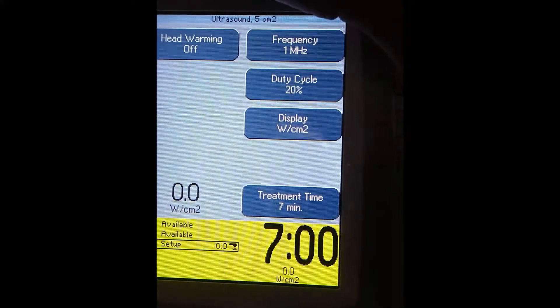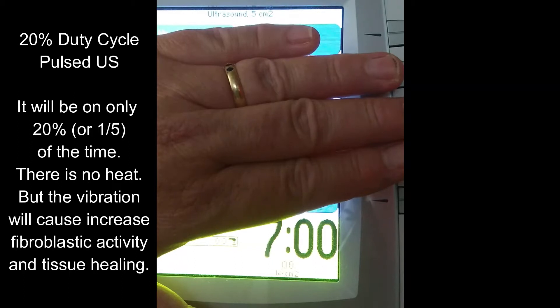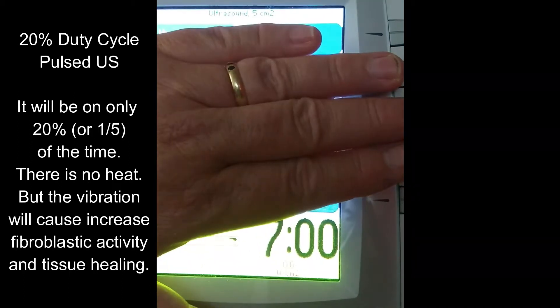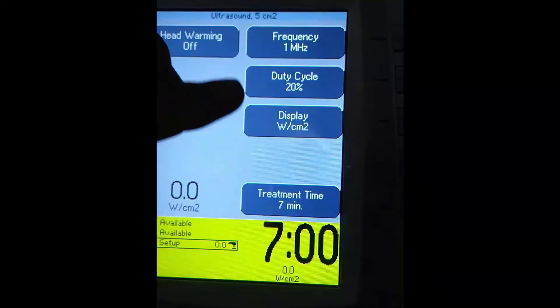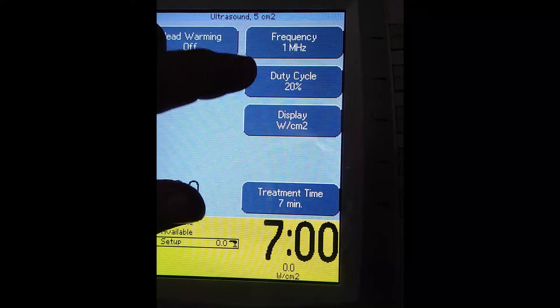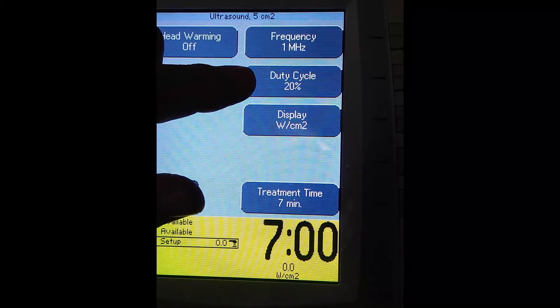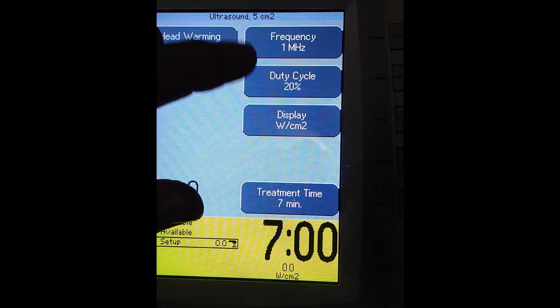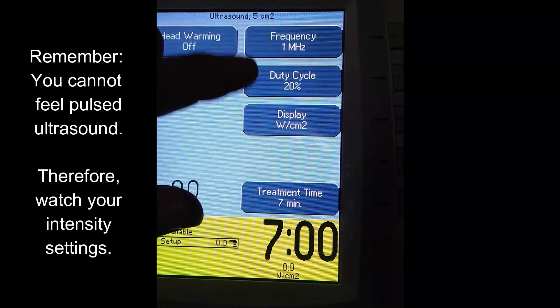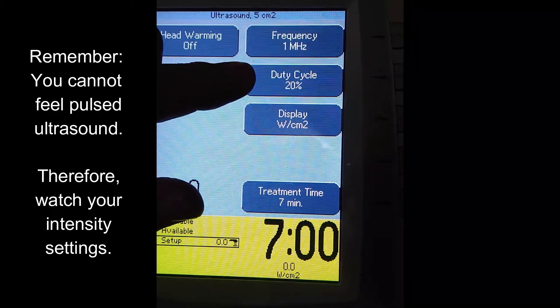Let's go to the 20%. The 20% duty cycle is like if I rub my hand every five seconds — I wouldn't generate heat, but I'd still get the vibration of the sound waves effect. So 20% means it's on one-fifth of the time. This is the setting we would use when we want to help heal tissues through increasing fibroblastic activity. Remember, patients do not feel 20% duty cycle, so as you turn up the intensity, there will generally be no patient feedback.